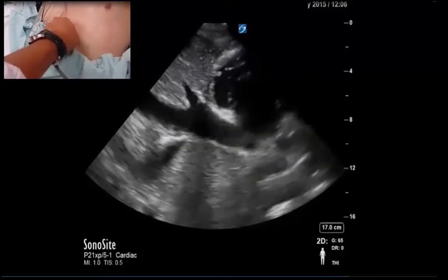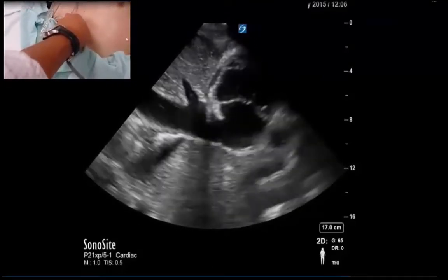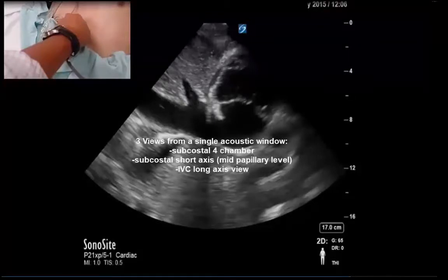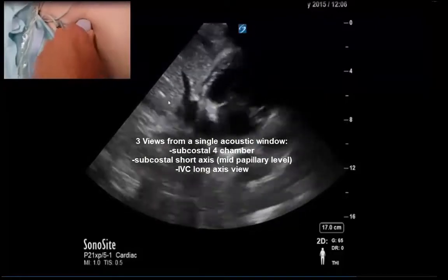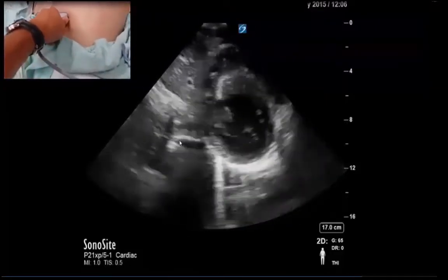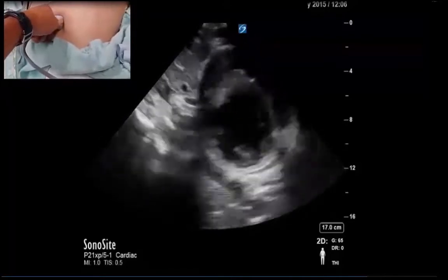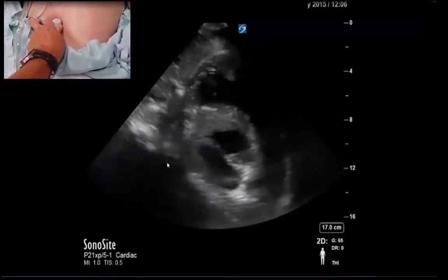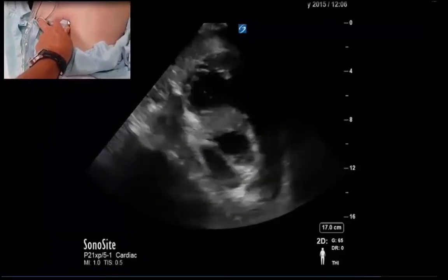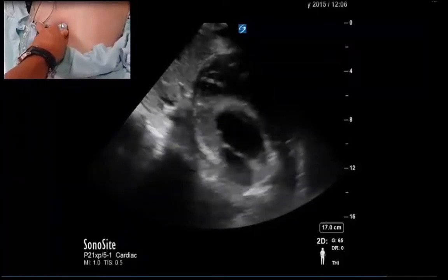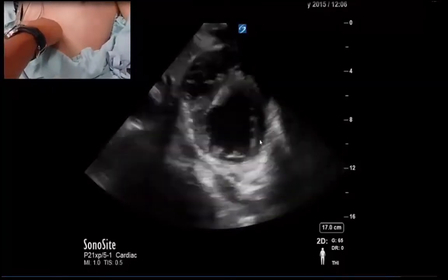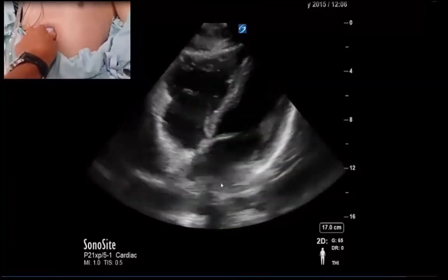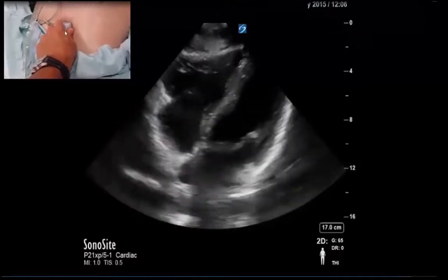With the index mark pointing towards the patient's head from the same plane, we can easily capture the IVC view. That's now three views out of the same acoustic window. In keeping with a dilated right ventricle, we see an unwavering IVC. Switching between different planes in the short axis merely involves tilting the transducer from left to right, allowing different cuts through the heart including a pulmonary artery view, mitral valve view, and all the way back to the four-chamber view by bringing the index mark back to the two to three o'clock position.